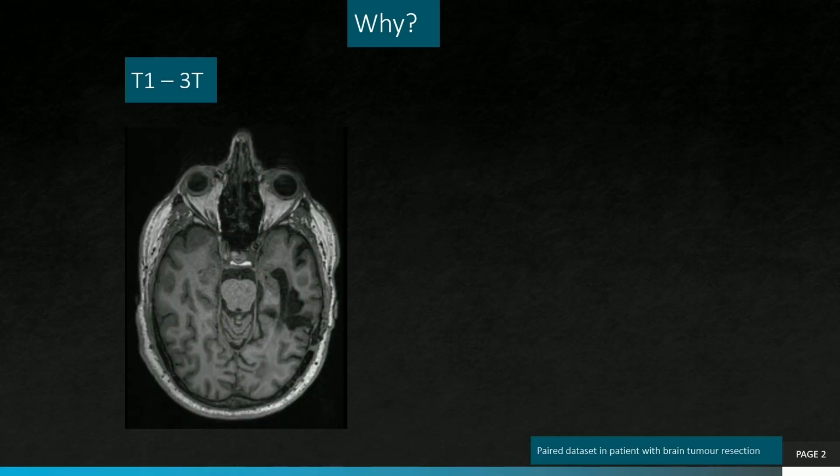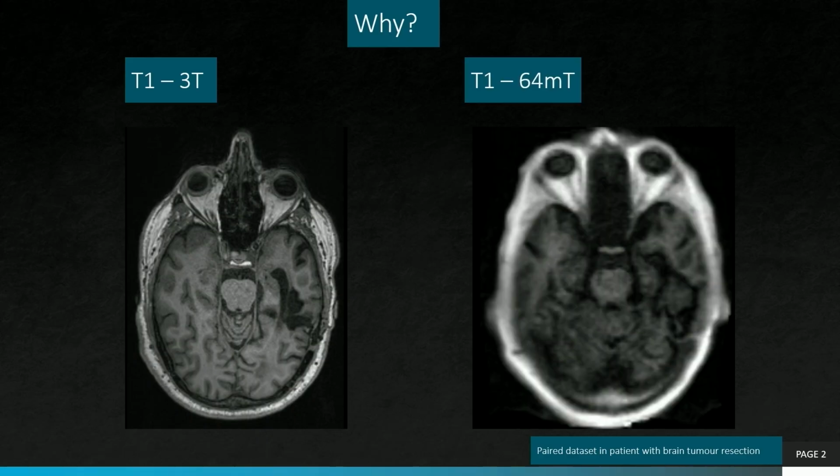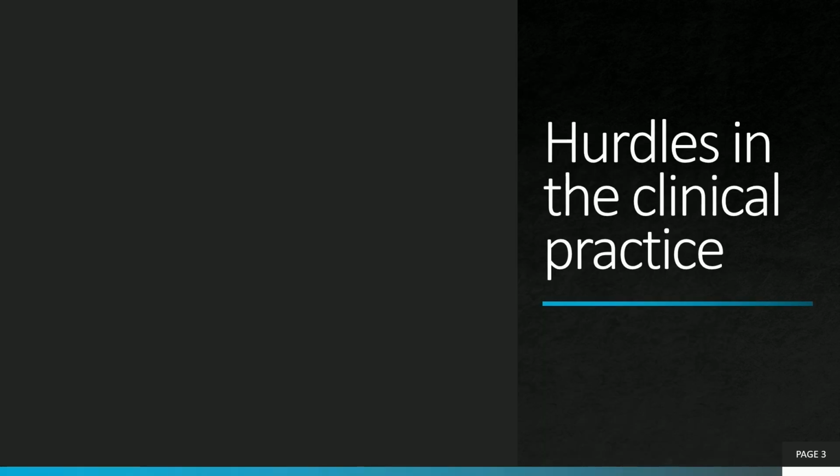So yeah, the question that I actually get a lot the last months and the last year from colleagues is: why, Karen? Why did you move into this dark side of ultra-low field MRI? Why did you decide to go from these high-field, crisp, high-res images to these really fuzzy images using ultra-low field MRI? Especially with my work in patients with brain injuries. And the answer to that question is actually the clinical reality.